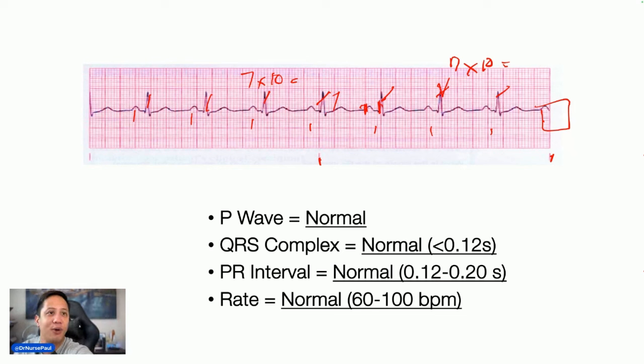Use your finger right now. Go. Put it on the screen. Does it look regular to you? Yes or no? That's how quickly you can do it during your EKG in the NCLEX, because there's case studies now in next-gen NCLEX. There's no rule about touching your screen. If the proctor asks what you're doing, I'm measuring my EKG. But in the NCLEX, use your fingers right away. Put it on the first P or QRS, and then move.